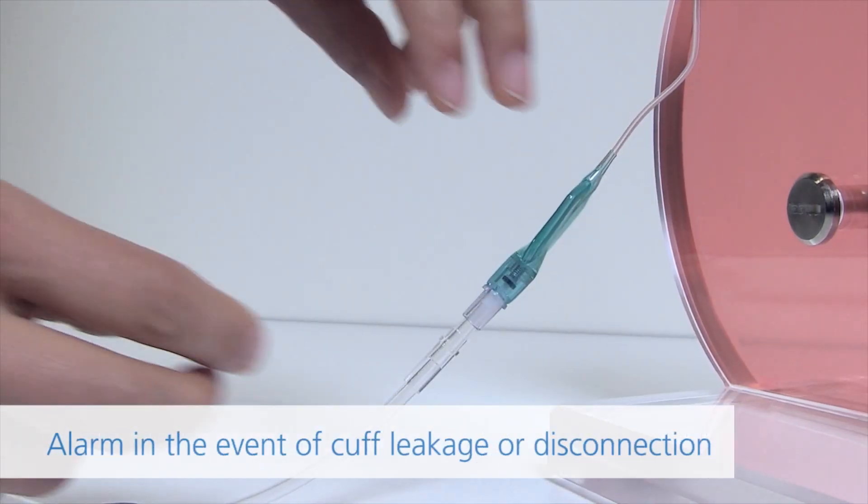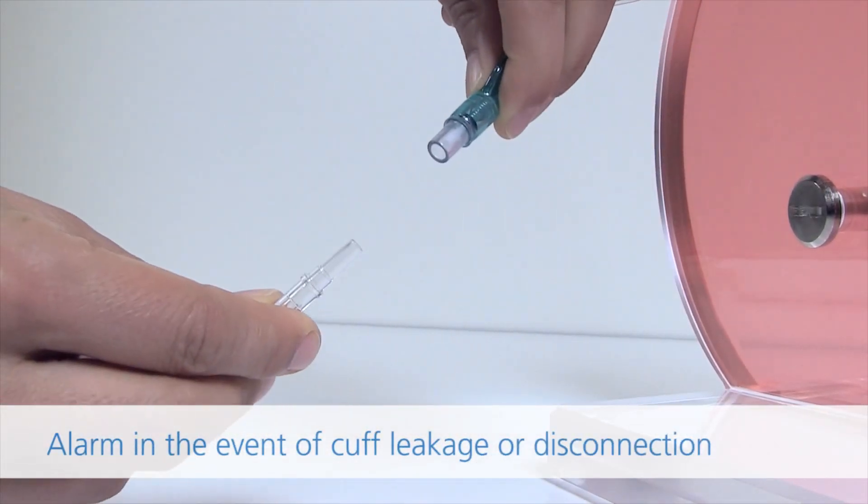Alarms. Alarm in the event of cuff leakage or disconnection.